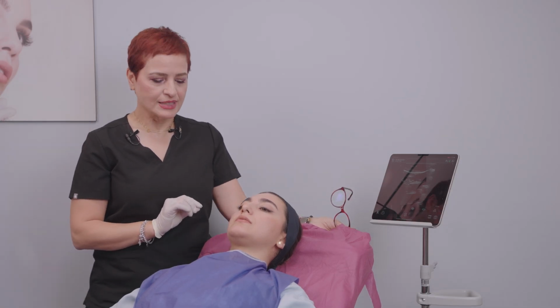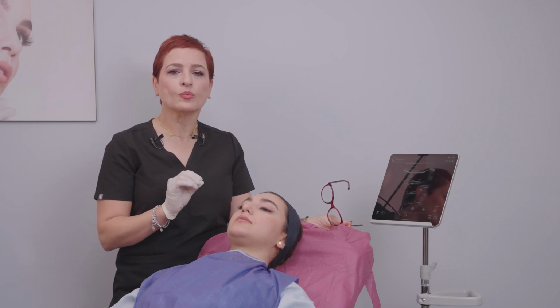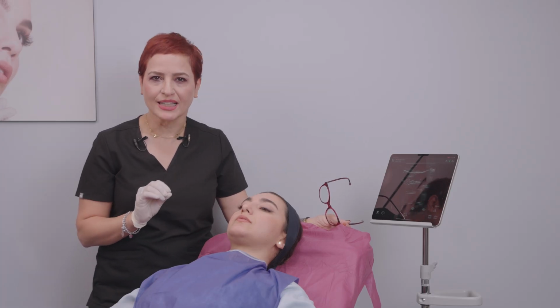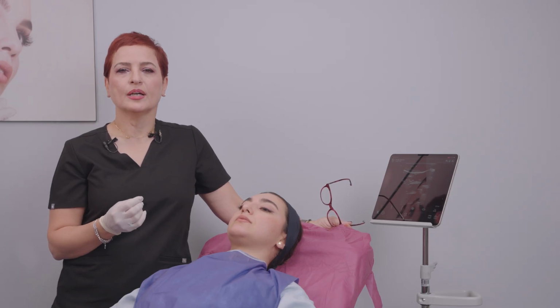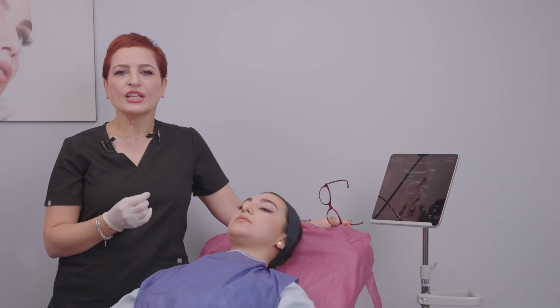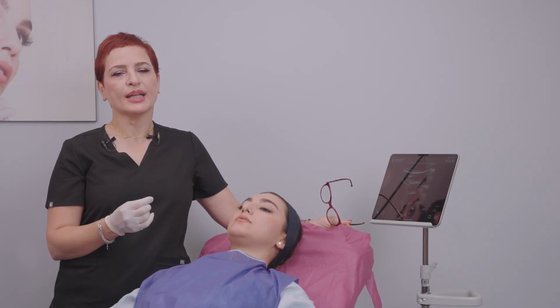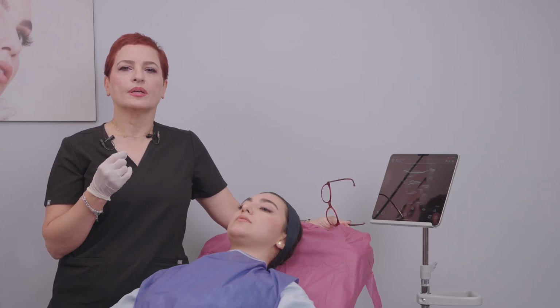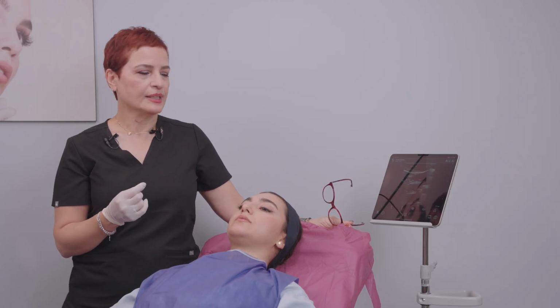I'm going to assess the patient's buccal fat pad, and it's important to assess because some people are not good candidates. It's good to explore the suitability for surgical or non-surgical reduction. If the patient has a thin and superficial fat pad, they're not good candidates and they might get injury to a very crucial structure, which is the vein or parotid gland.